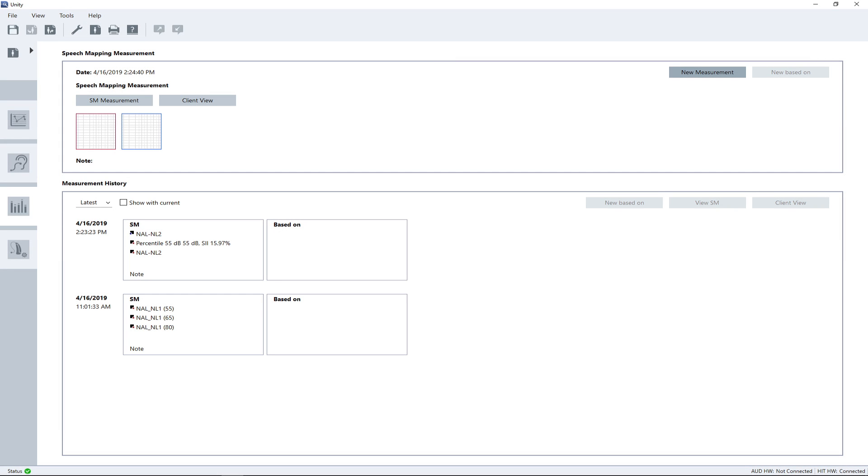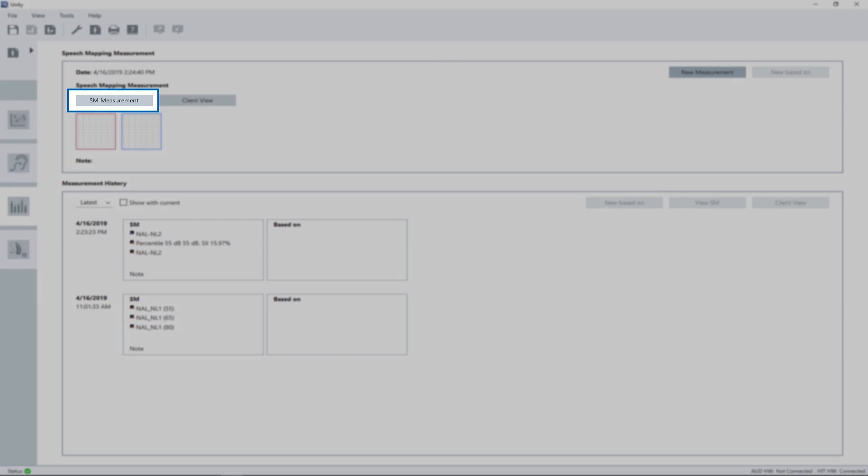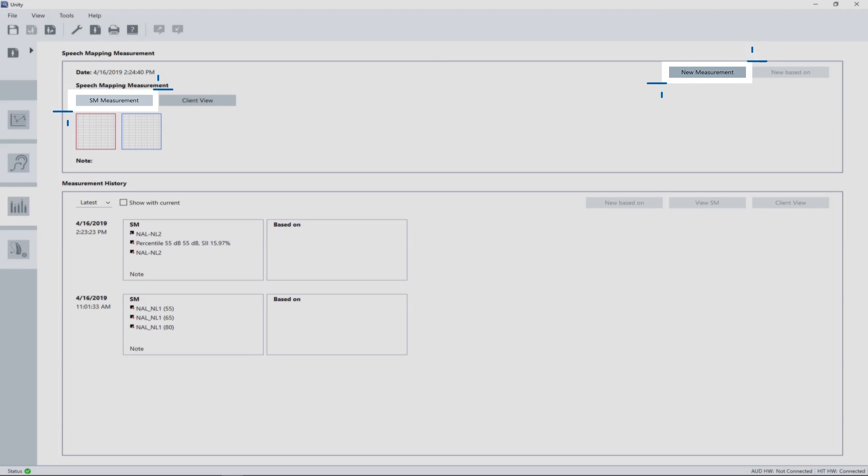To open the measurement window, simply click on the SM measurement button. In case you want to start with a clean and empty grid, click the new measurement button prior to opening the measurement window.